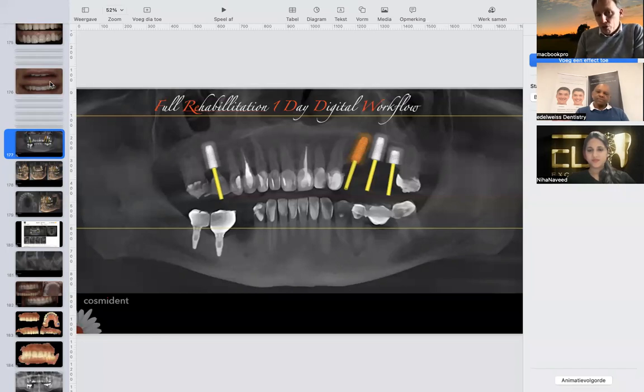The other way is what I showed you, going with a temporary material, like the PMMA material we used before. But nowadays, I don't go with temporary materials like PMMA anymore. I go directly with Edelweiss, because if the patient feels it is too high, the material is strong enough to wear, and it will wear out a little in the parts where he finds the occlusion, and it's easy, and that's a good thing.